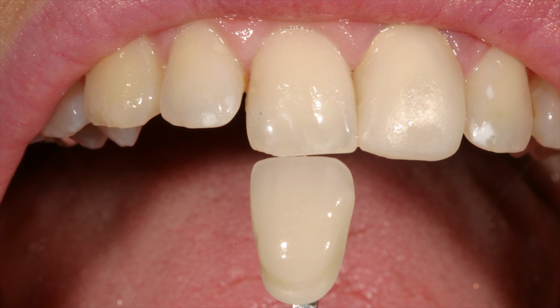Here's an instance where we actually turn the incisal to incisal, and I have a lot of questions to ask. Do we do incisal to incisal in a photo? Do we do gingival to the incisal? Honestly, there's no wrong either way. As long as you pick the right shade tab and you document it, we're going to see that through the documentation of the digital photography. Sometimes you're going to find that an incisal edge might be maybe a 1M1 and maybe the gingival part will be a 2M2. So that's where you might want to turn the incisal of the 1M1 directly to the incisal edge of the central like you see here. But when you do the gingival part, you might want to turn the gingival part up towards the incisal edge.